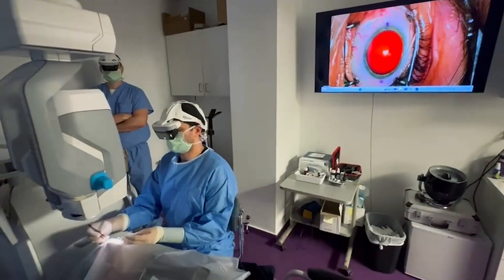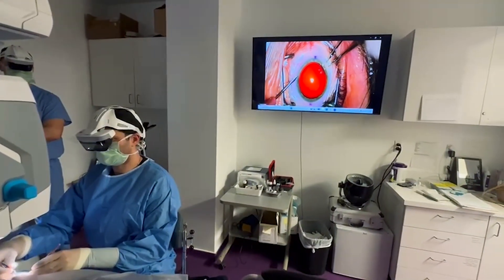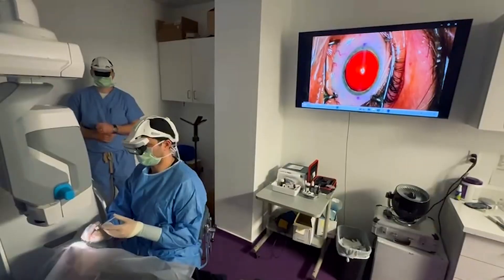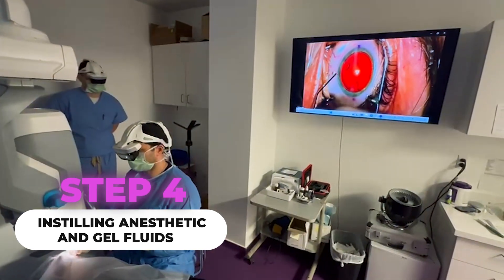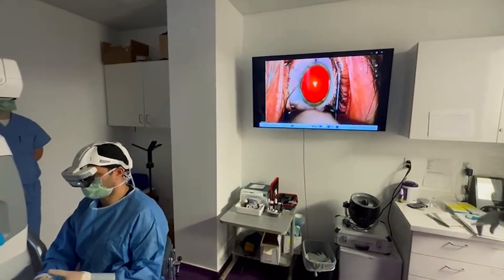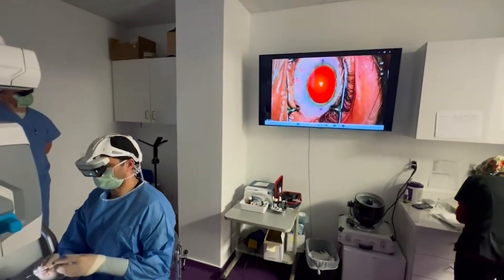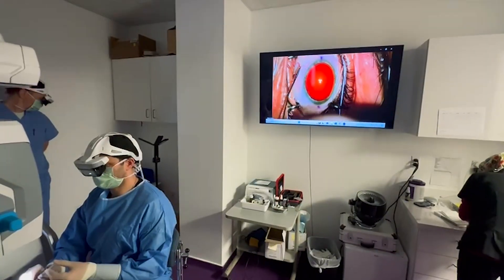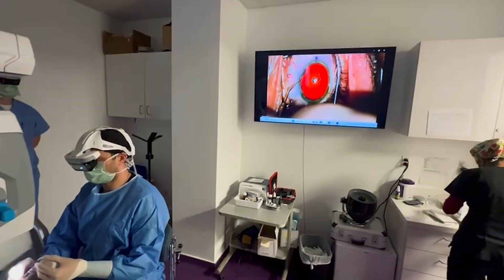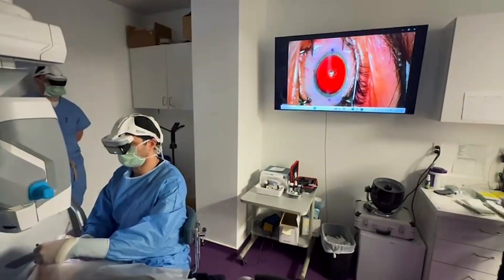The first step is what's called a paracentesis, or a side incision. You can see it's on a bit of an angle. This helps me ergonomically later in the procedure so I can put instruments in to tuck the little flanges on the edge of the lens and position without torquing the cornea too much. This is followed by a preservative-free anesthetic lidocaine with a little epinephrine that keeps the iris dilated and the patient numb, though this process can sting a little bit — it's really the only discomfort some people describe. After this is more of that jelly, the viscoelastic solution that helps maintain the anterior chamber of the very front passage of the eye.